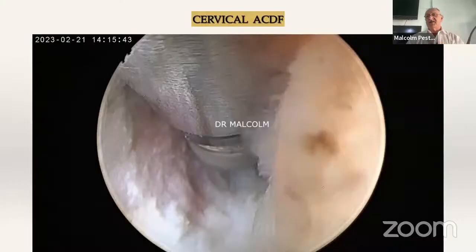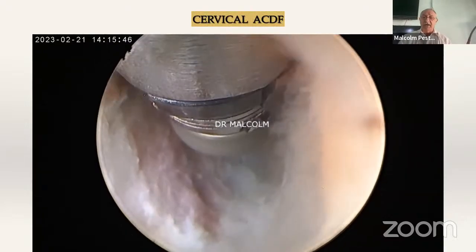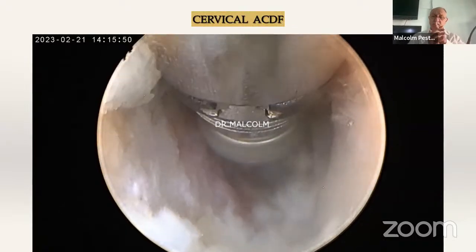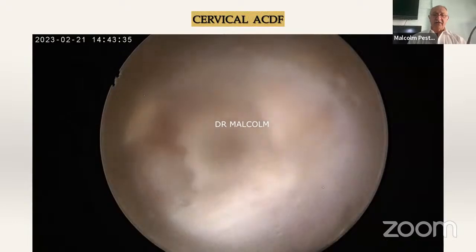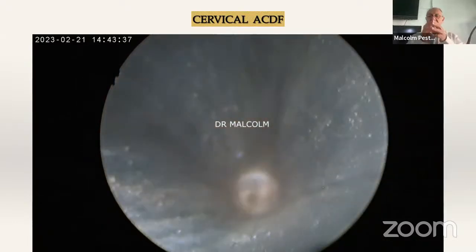Now we also do cervical ACDFs, but here we switch to monoportal. And this is a video showing me doing a complete cervical ACDF using the scope, even the cage has been put using a scope. There is no opening up of the patient, no using of any retractors. And this is the cage going in. I use a hemi-cut cannula to slide in the cage from below the dura, below the esophagus.